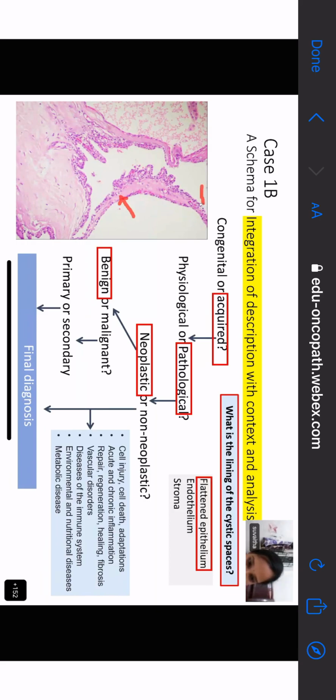So there are clear cytoplasm. There are many cells that show clear cytoplasm. So Veda, can you see them? Yes, ma'am. Excellent. Dia, did you see them? Yes, ma'am. Okay. So what does clear cytoplasm mean, Suveta? There is secretion in it, ma'am. There is secretion inside them. What sort of secretion? Clearing means what?